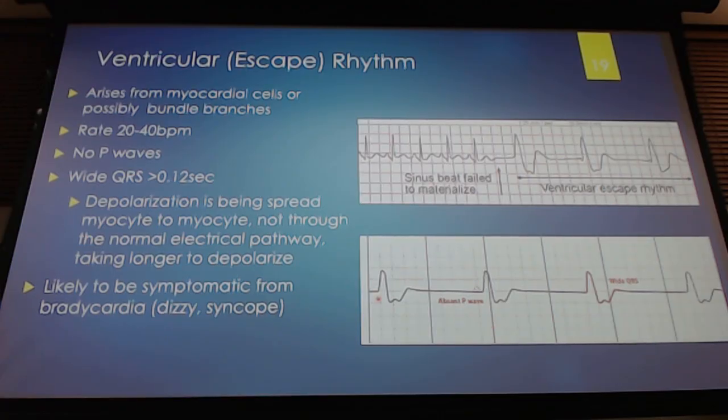And so here on the bottom, we have a wide QRS complex, and we start from the beginning of the QRS complex all the way to the end. Okay, wide QRS complex, so Q, we don't have a Q, but R, and then we come down to our S, and this is coming up to our T here. So look at what this little thing is. That's actually a P wave. Again, that's embedded in that QRS complex. So we're getting some depolarization up there, but it's not what's pacing this patient. What's pacing this patient is this wide QRS, and that's coming from our ventricle.